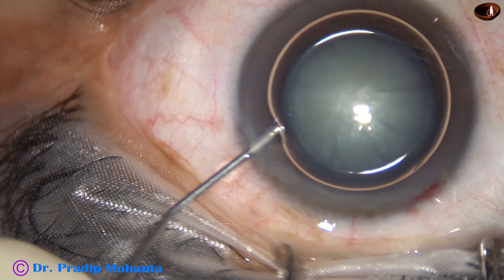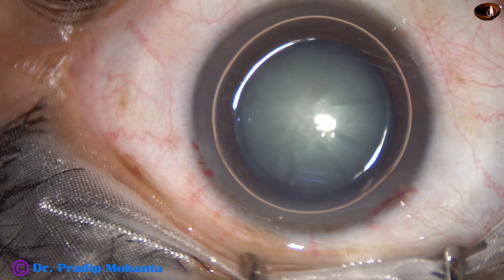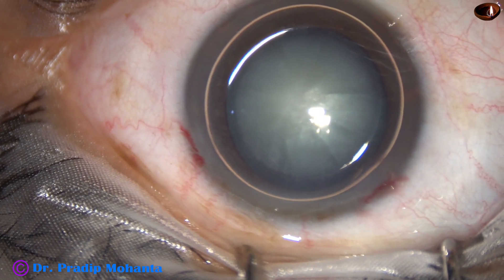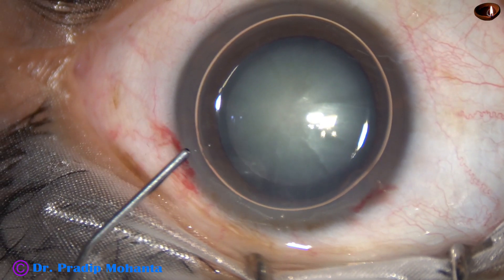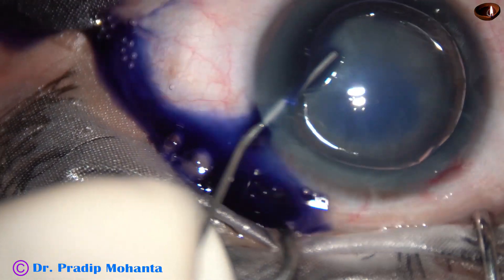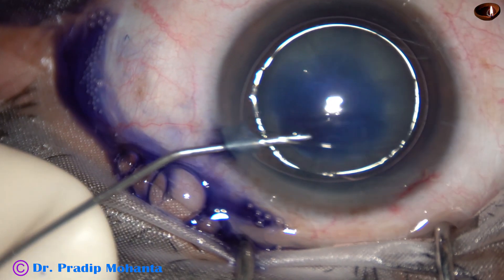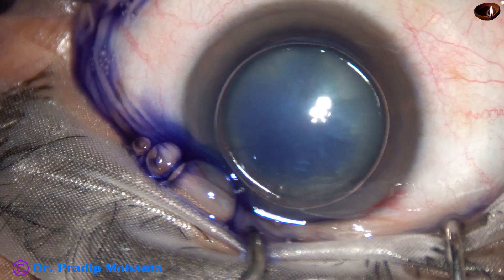Now an air bubble is injected. Underneath this air bubble, Trypan Blue dye is applied over the anterior capsule. The dye is applied in such a way that there is a nice staining of the anterior capsule.